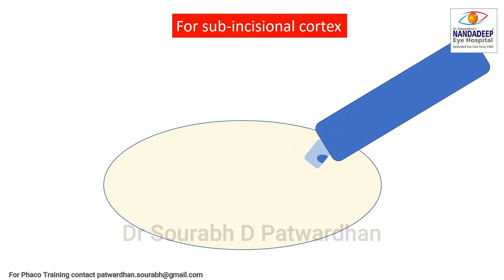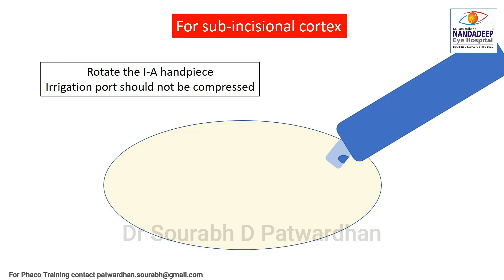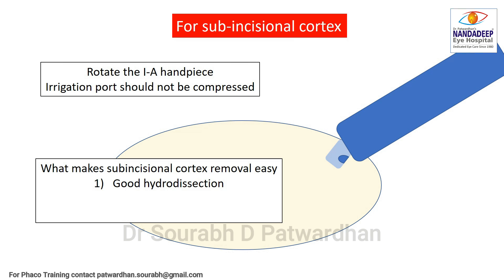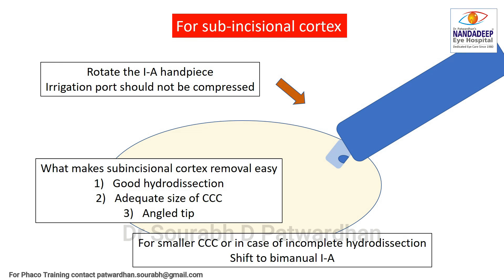Another important part is removal of the sub-incisional cortex. For that, you have to rotate the IA piece, making sure that the irrigation port is not compressed. For ease of removal, it is important to have good hydrodissection and nucleus rotation, adequate size of the CCC, and an angled tip. If the CCC is very small or hydrodissection was not properly done, it is better to shift to bimanual IA to avoid any problems with sub-incisional cortex removal.